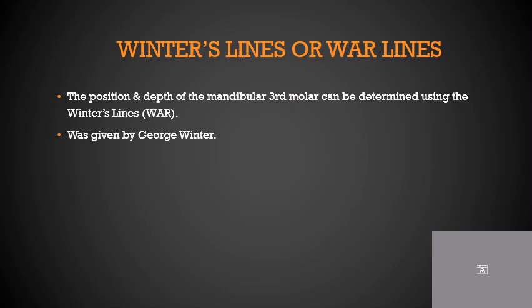So coming to the determination, how do you appreciate the tooth in X-ray? Winter's lines, or war lines, were postulated by Winter to understand the positioning of the impacted tooth with respect to the norm. The position and depth of the mandibular third molar can be determined using Winter's lines. It was given by George Winter.